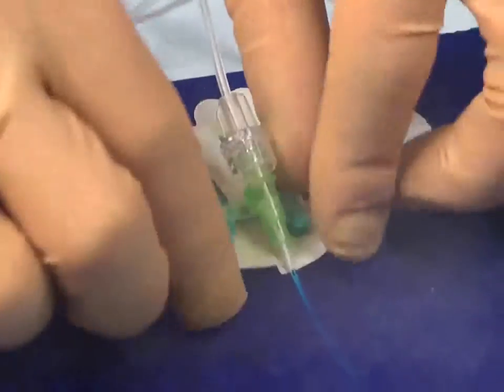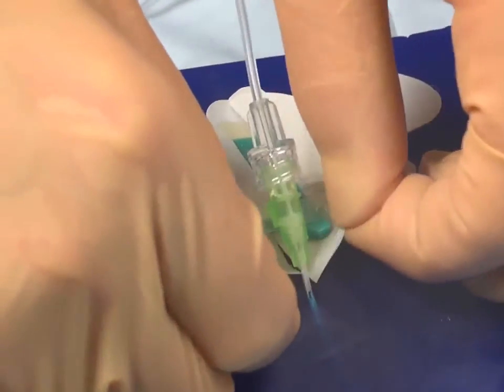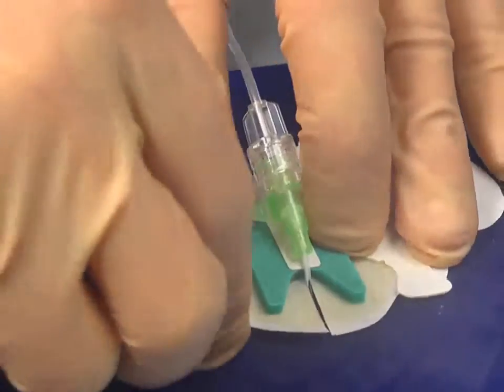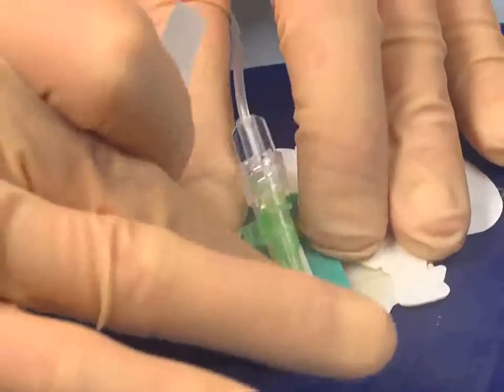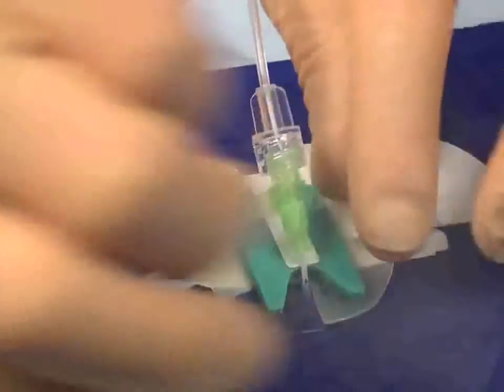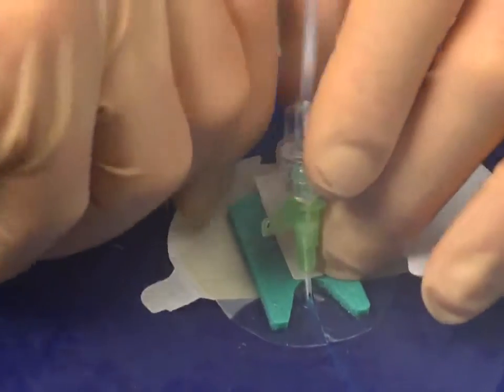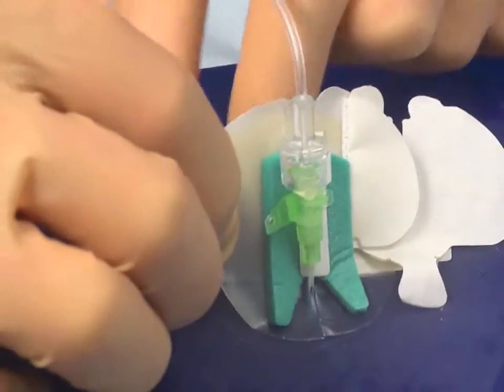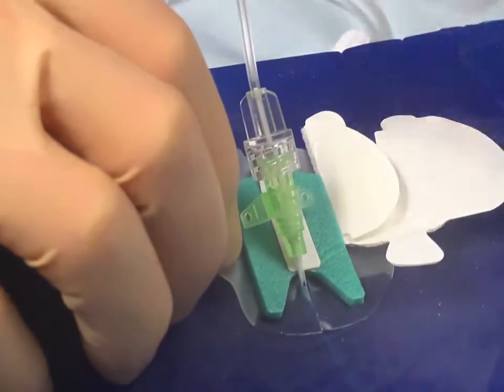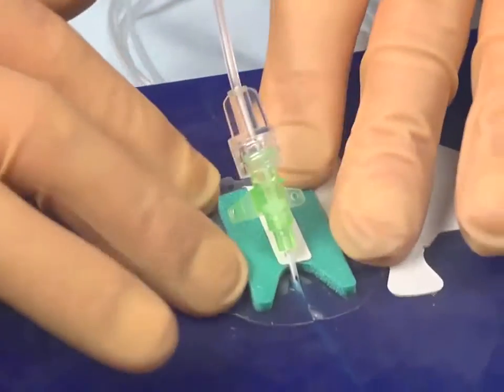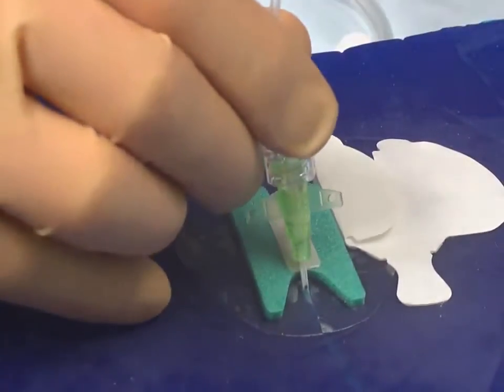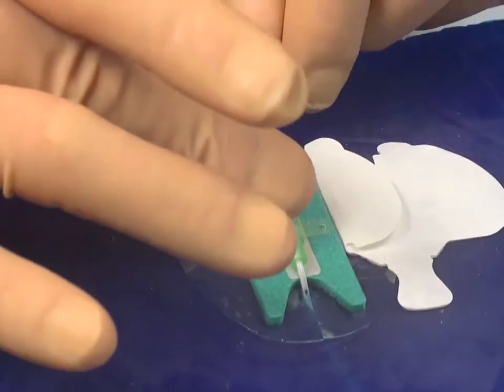An alternative fixation device is the Pajunk fixer-cath. Firstly, insert the fixer-cath beneath the e-catheter. Remove the front paper flaps and stick down the fixer-cath. Carefully lift the rear, remove the paper flap and stick down the rear of the fixer-cath. Peel off the centre strip and apply the wings of the e-catheter to the fixer-cath.